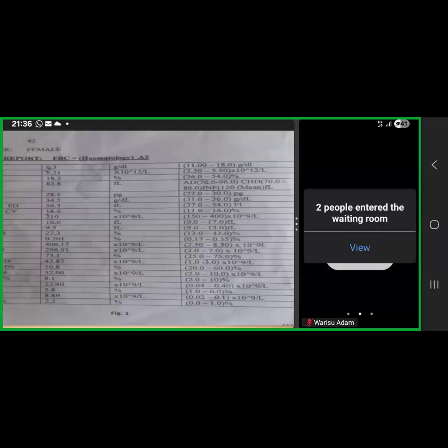And don't forget that workups in a hematology setup begin with your full blood count, followed by evaluation of a film. We said that when we did route to diagnosis. Depending on what you see on peripheral blood, it serves as pointers to what can be done next. Here's a case, we have a full blood count result.